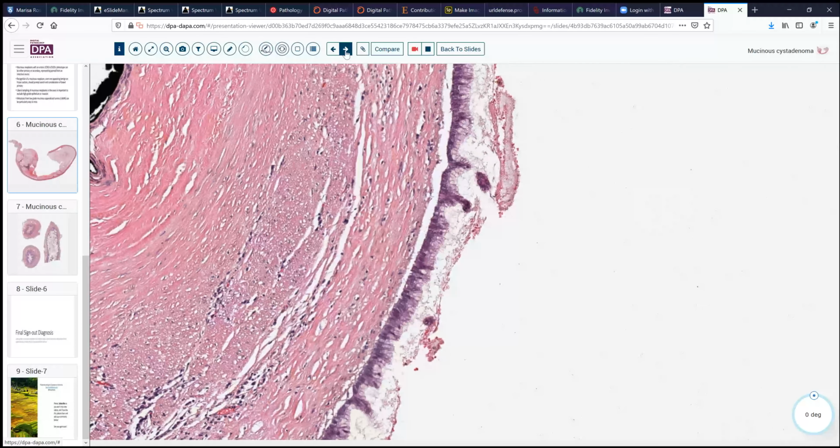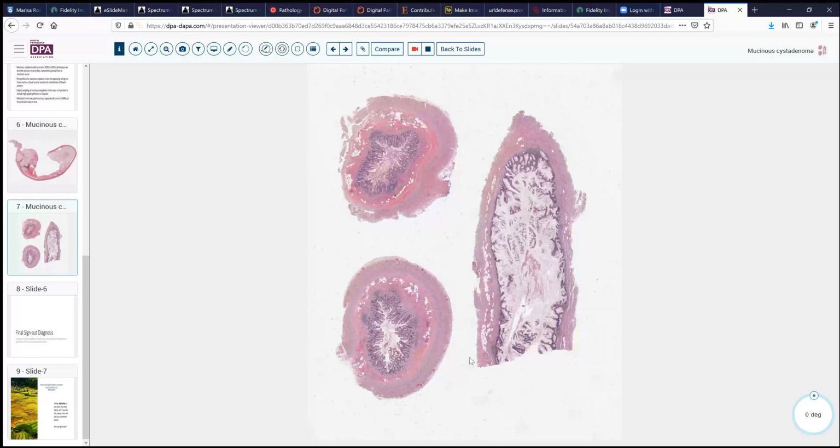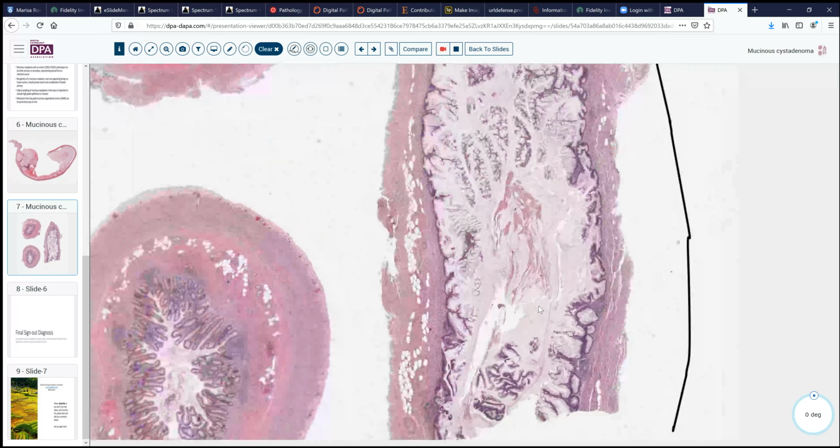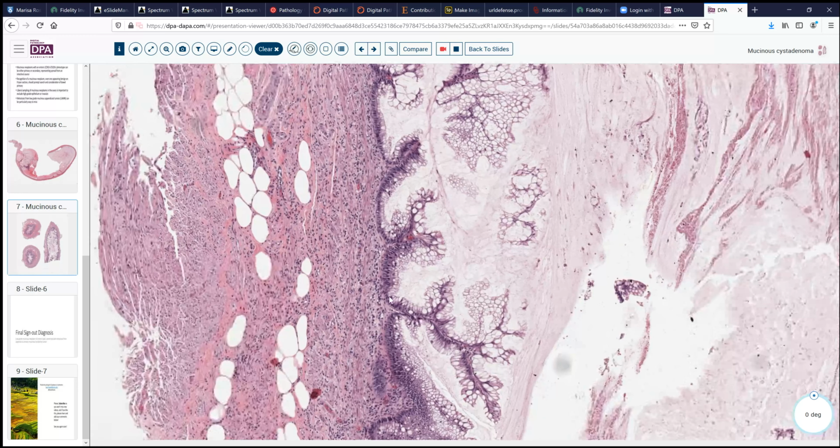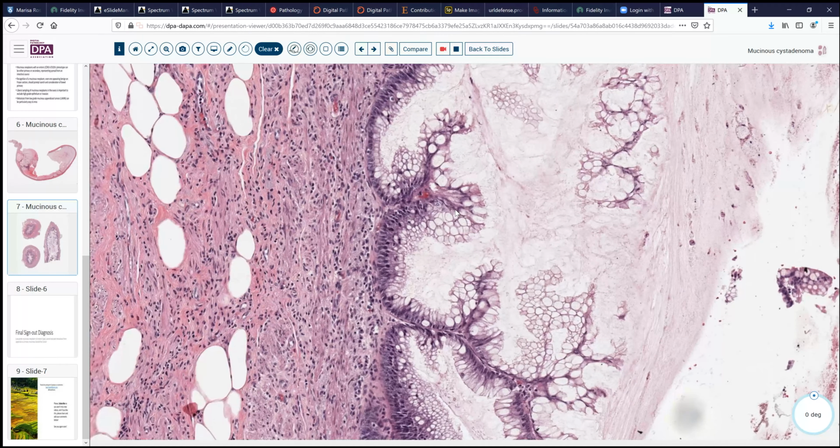Let me show you a similar example and show you the reason why. So here's a normal size appendix, and here's the distal appendix here, which shows you that the appendix is not even dilated, or very minimally so. And so when we come down and look at this and see that, yes, this is a mucinous neoplasm of the appendix, it's very low grade, it's got this enteric phenotype and so forth, it's got this borderline tufting and papillarity to it.